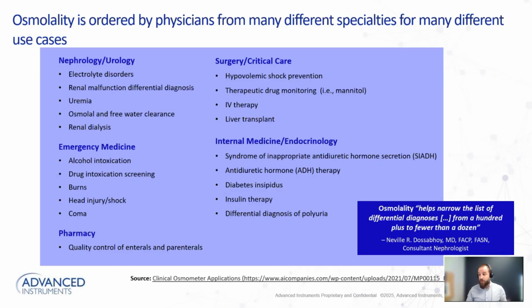In surgery and critical care, it's also a helpful tool for hypovolemic shock prevention and therapeutic drug monitoring. So I talked about mannitol as a tool for relief of intracranial or intraocular pressure. And then in internal medicine and endocrinology.